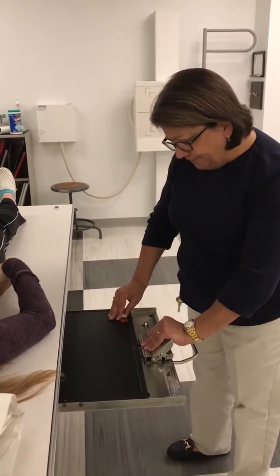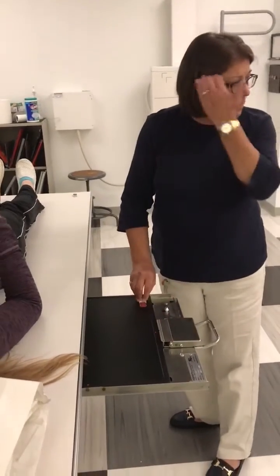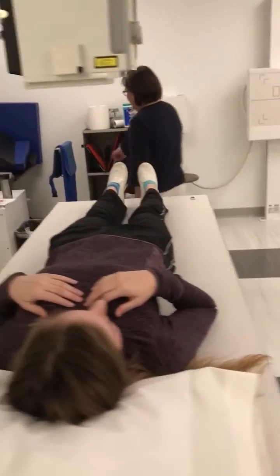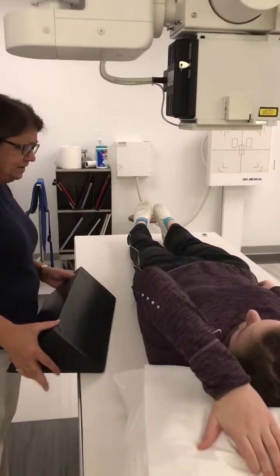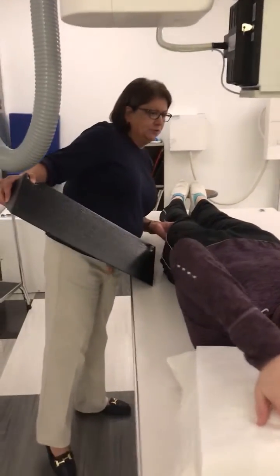I use a 14 by 17 IR lengthwise. For the RPO, I'm using my right marker placed inferiorly to the outer edge. I'm going to get that positioning sponge. Then I want you to scoot toward me just a little bit on the table. All right, and we want to make sure our patient's straight on the table.